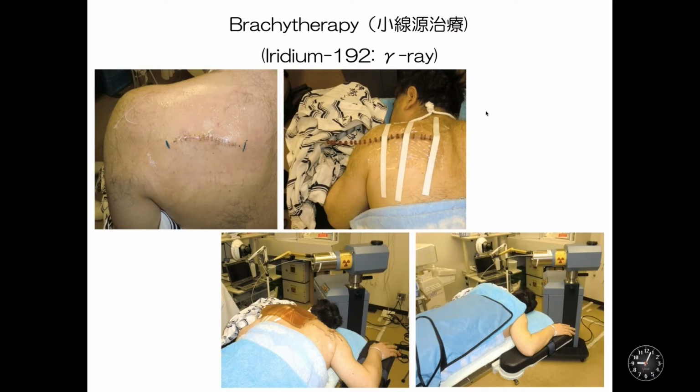And sometimes for incisional wounds, we have used external brachytherapy.